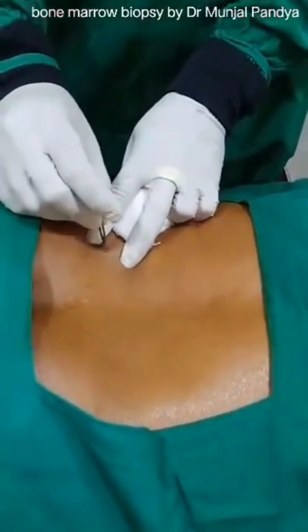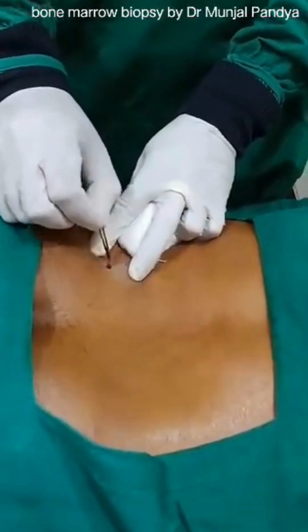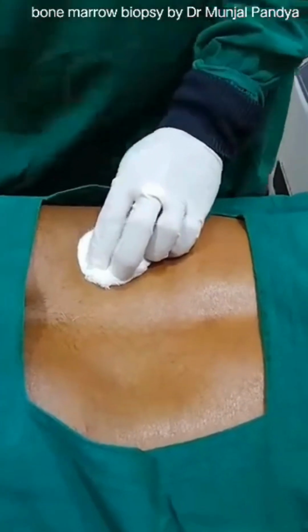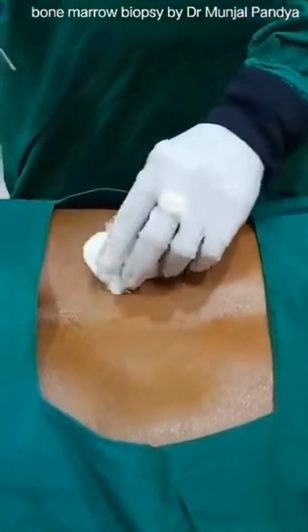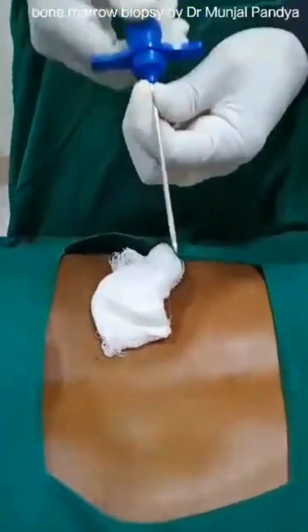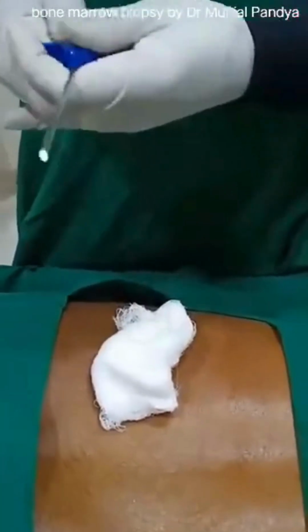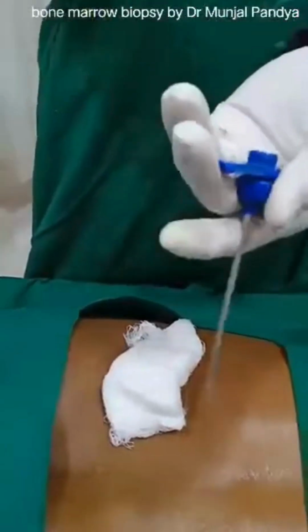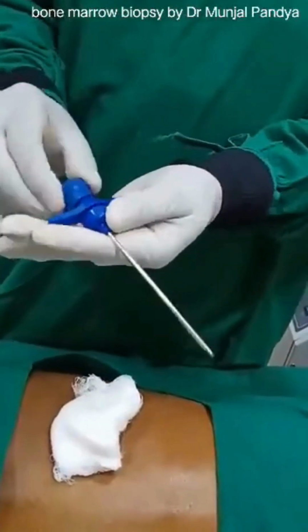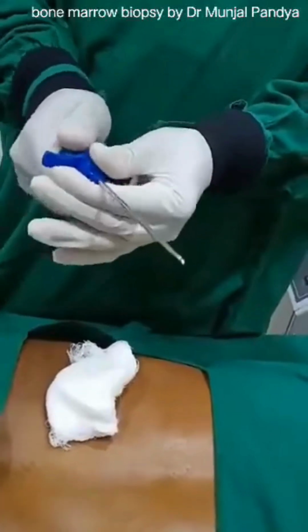So now I am going to give a small incision, which helps me to introduce my bone marrow needle into the bone and periosteum and reach the bone marrow. So this is a bone marrow biopsy needle. Before entering the bone, we have to check this needle, whether it is patent or not, whether everything is okay. So I am checking this bone marrow needle. It looks okay to me. This is a Jamshidi needle for adult size.